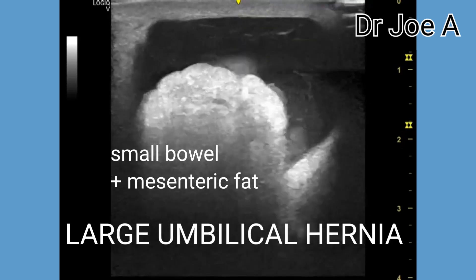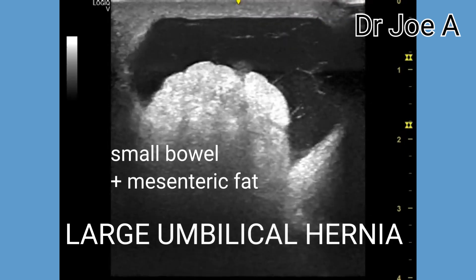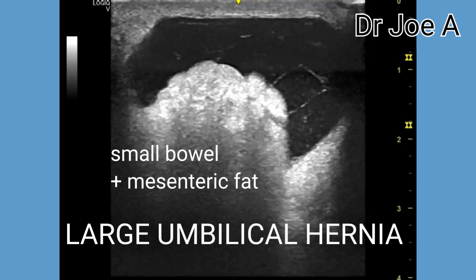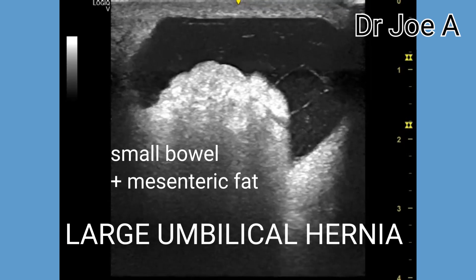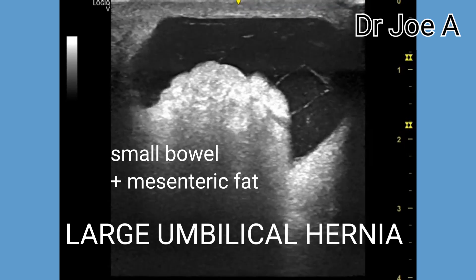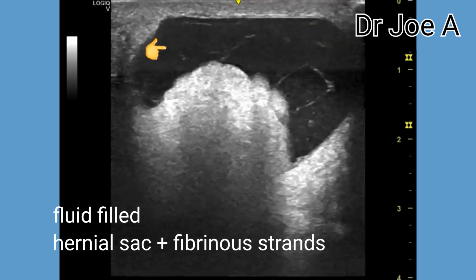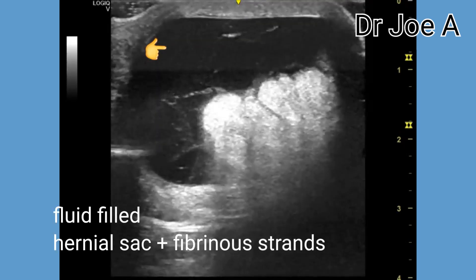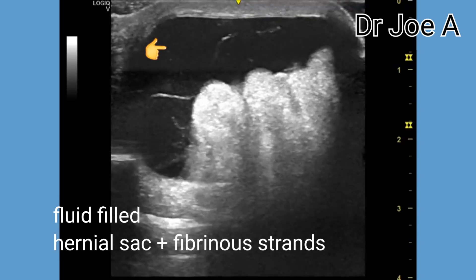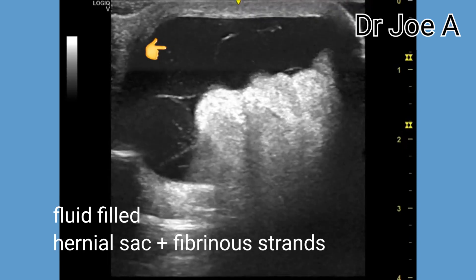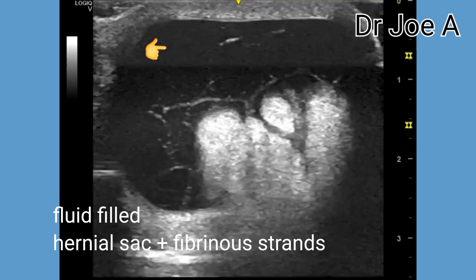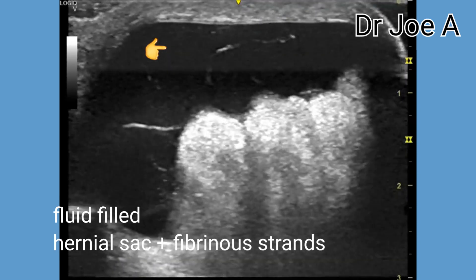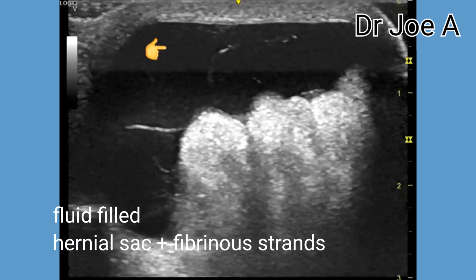In this case the patient was an adult male with a large umbilical hernia. In adults, umbilical hernias may develop due to factors such as obesity, pregnancy, heavy lifting, or previous abdominal surgery.